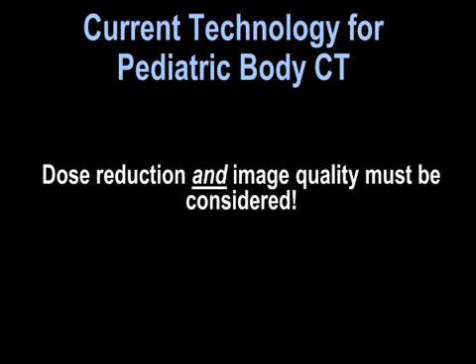We also have to consider that, as you've heard, dose reduction is balanced by image quality. And while we continue to push the envelope lower, there is going to be a threshold at which we will be too low. I think you've sensed from some of the images up there that we're close to that. I would argue that we still have to get to that point, but we are much closer to it than we were 10 years ago.